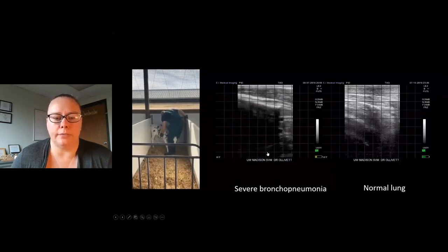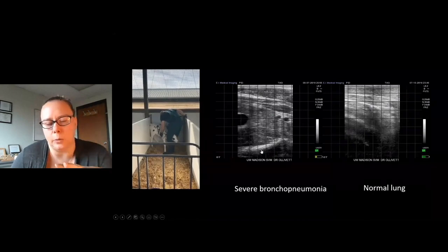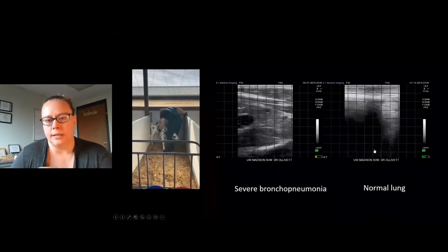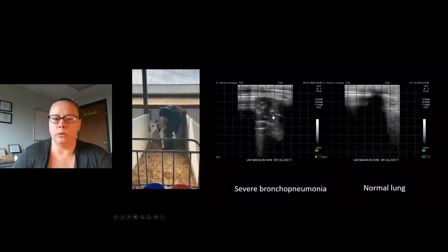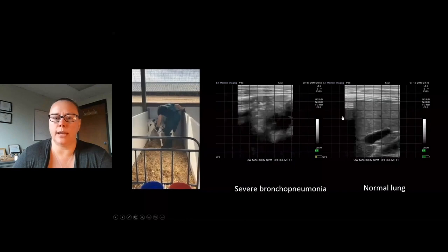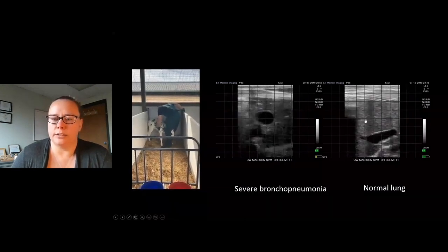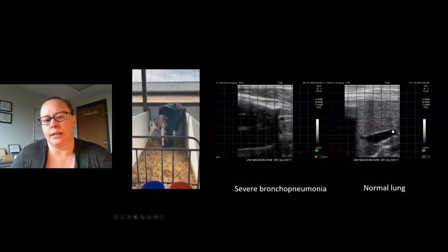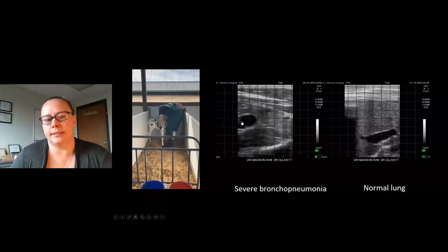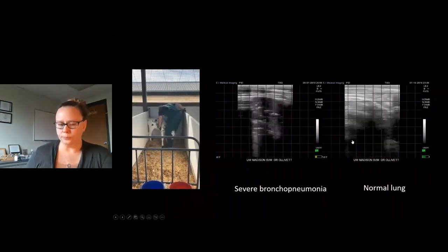So this calf I just showed you in that 10-second clip has 3 lung lobes that are completely consolidated, so it's a score 5. Again, this is so you can visualize the difference between abnormal and normal in these two calves. Now, normal calves do have this structure here. This is the liver. This is why ultrasounding takes some training, because liver looks a lot like consolidated lung. So we need to make sure we don't make that mistake.